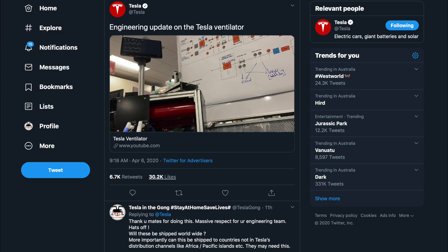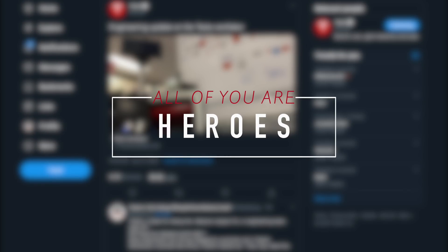Today, Tesla released a video outlining their efforts in creating a homegrown ventilator machine. Before we go into the details, a massive thank you is due to all the folks at Tesla for doing this — and not just Tesla, but every other company and group out there helping in this time of utmost need. You guys are all heroes in our books.